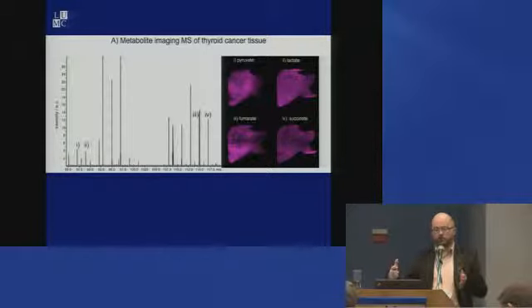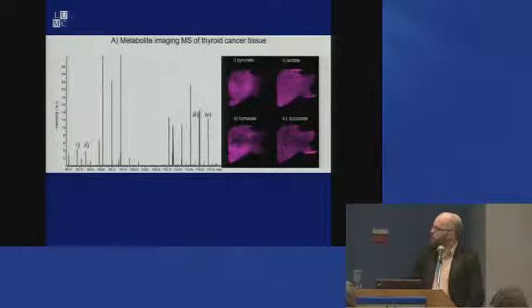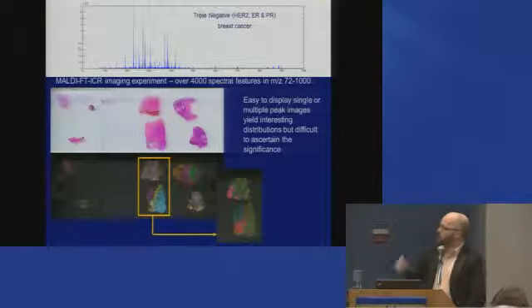Other instruments are designed for such a low mass range, but they don't have the same level of mass resolution. As we'll see later, each of these peaks has multiple isobaric peaks behind it. That's why we need the ultra-high mass resolution.